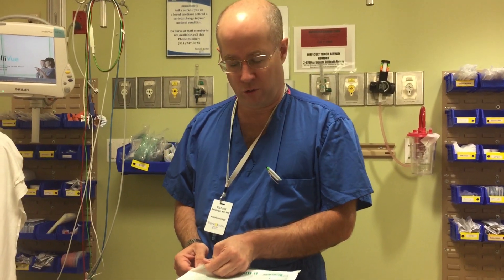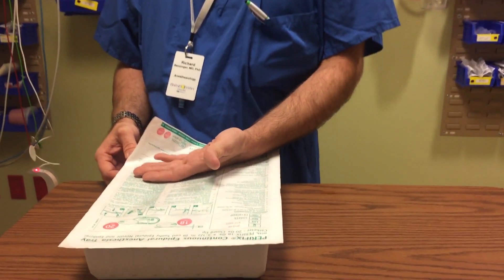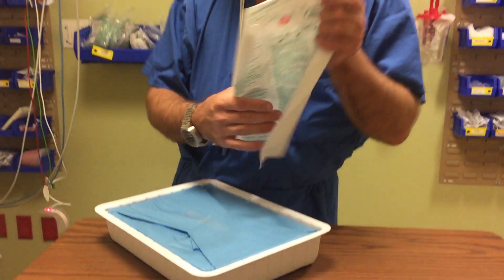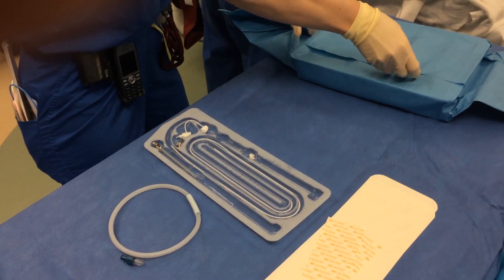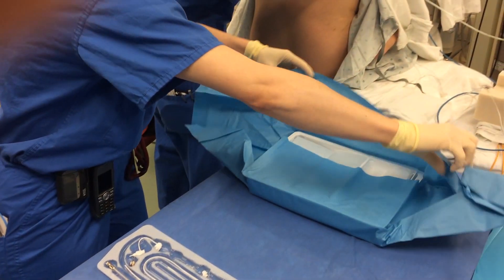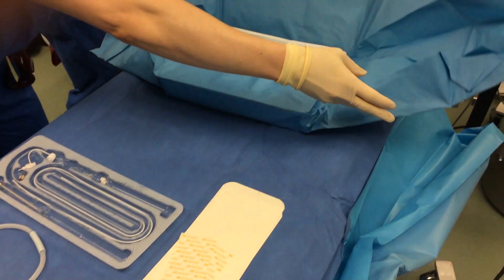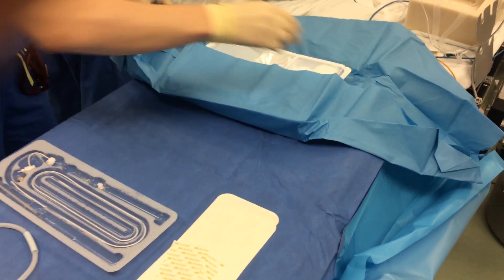Once sterile, with the patient sitting up in the same position as for an epidural catheter, we would usually set up our field including the epidural tray to provide a sterile field.